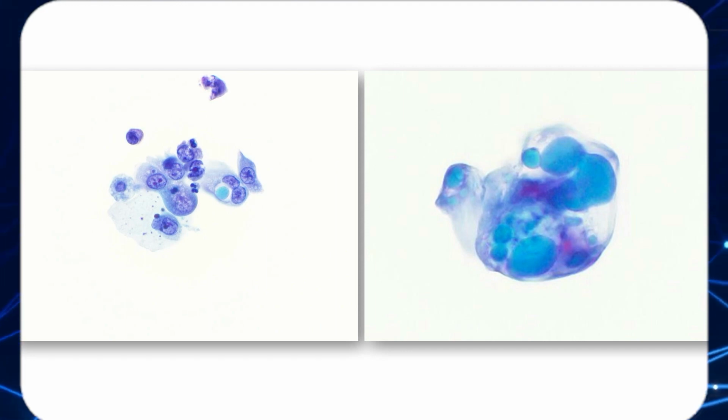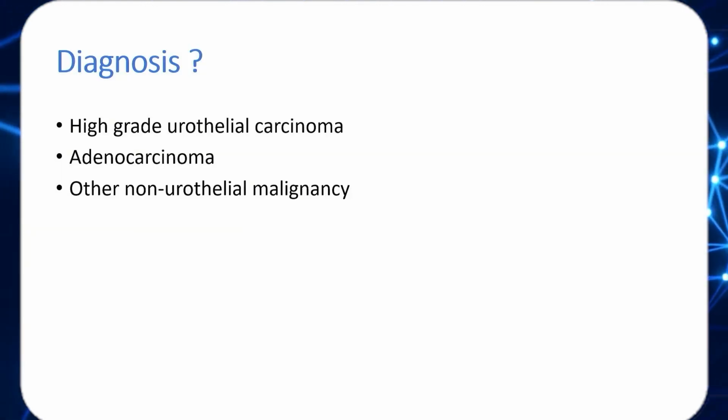I started looking at it in some of the cytoplasmic details when I looked at it at a higher magnification. And this is degenerated group of tumor cells with, again, this proteinaceous material. So obviously these are cancerous cells. Can I make a diagnosis? If I can, how should I slot it?